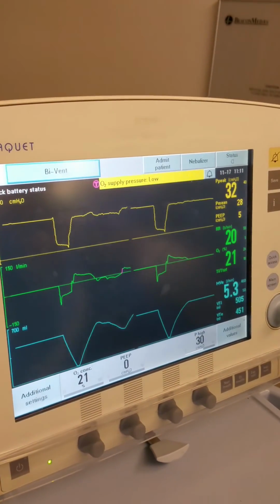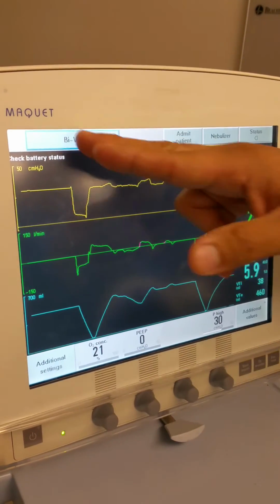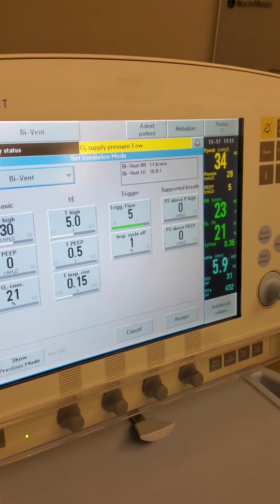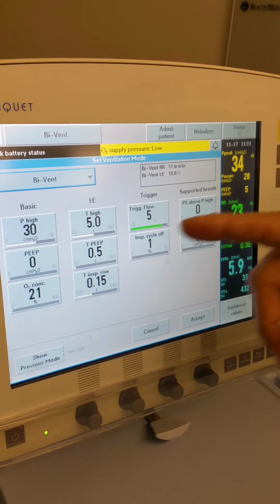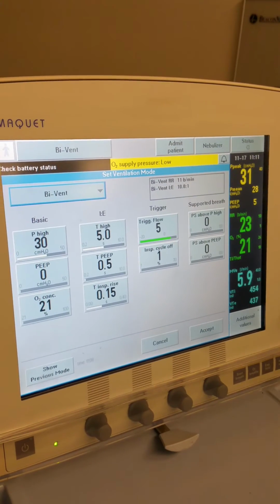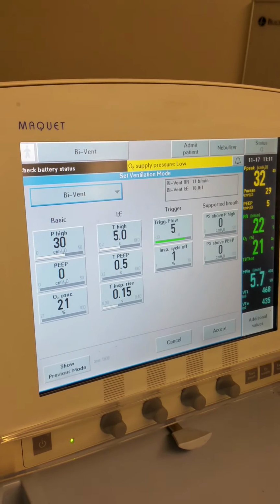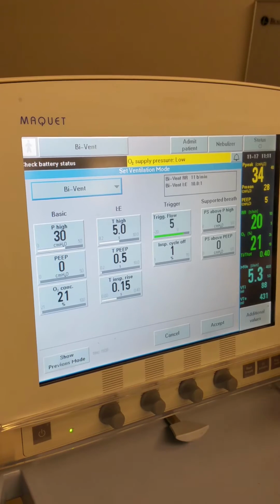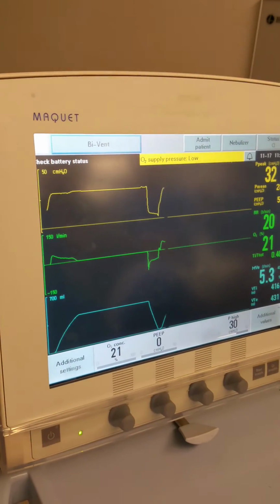The other thing that you can do secondarily is adjust your T low, but once you get that ideal, you don't want to change that. Technically you're going to have more release if you change your T low, so your overall tidal volume might increase. But once it's ideal and at 30 to 40% release, we don't want to change it. So if we need to increase our tidal volume, we're going to go up on our P high.